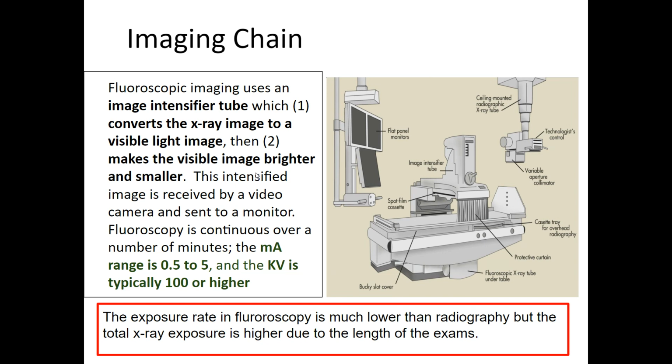This video is going to be sent a couple of different places. It's going to go to the monitors here, but it's also going to go to the computers. And I'll show you an image where there's like a mirror that splits the signal between monitors that might be inside, monitors that are outside, and then send that image to an analog to digital converter, turning it again into ones and zeros, so then we could get it into the computer and do fancy things to it.